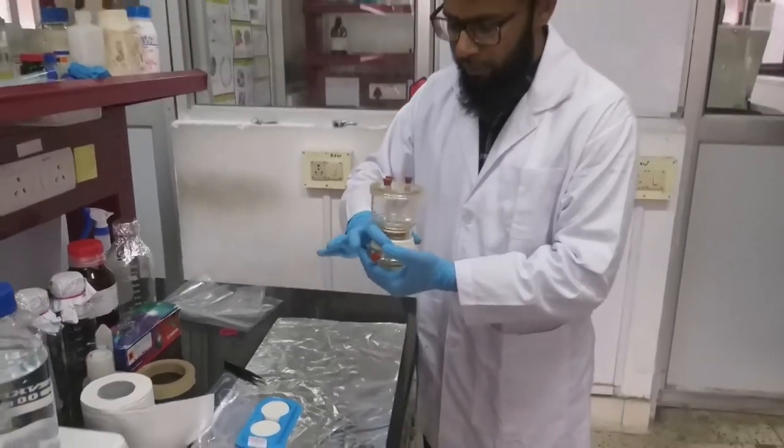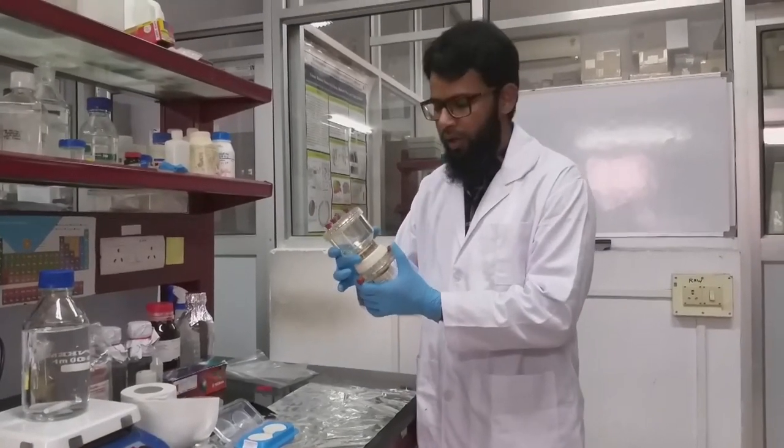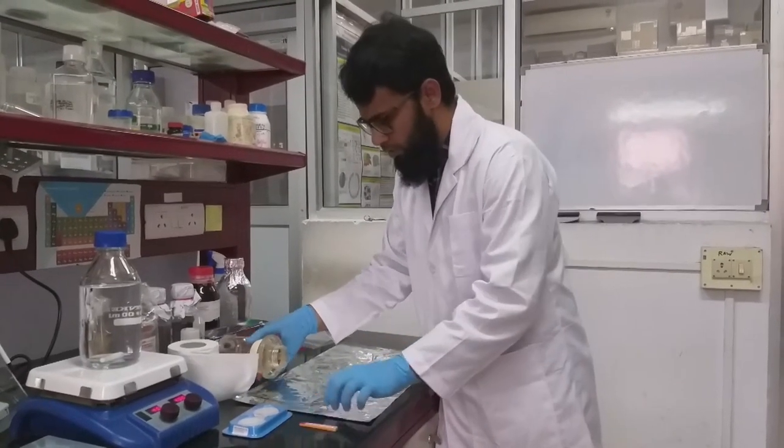We have to pack it closely so that it doesn't allow any leakage, and after this we have to put it for autoclave. This is an autoclavable bottle top filter.